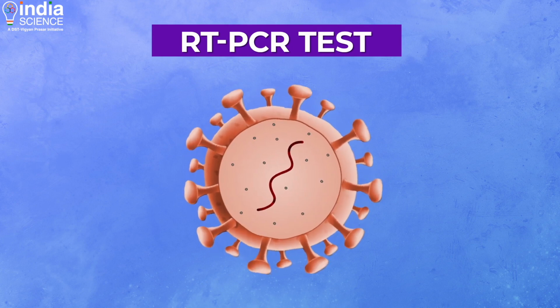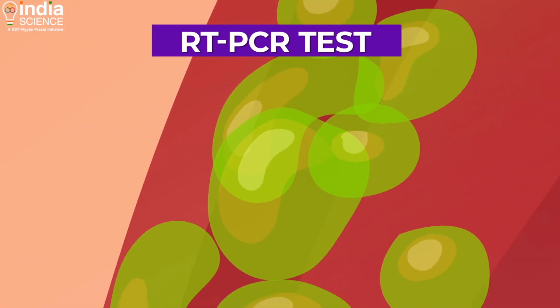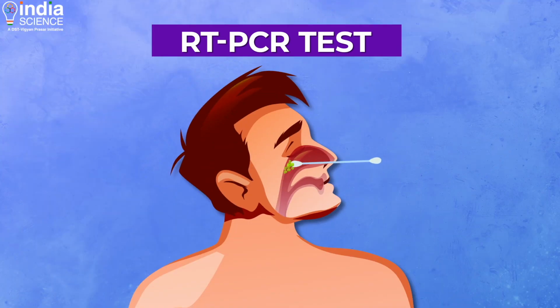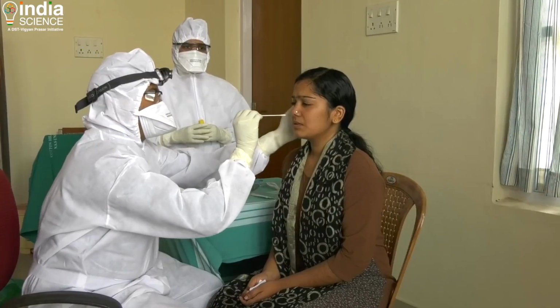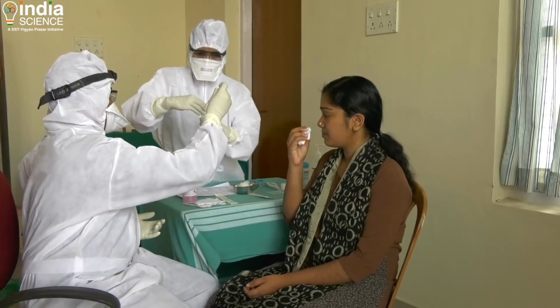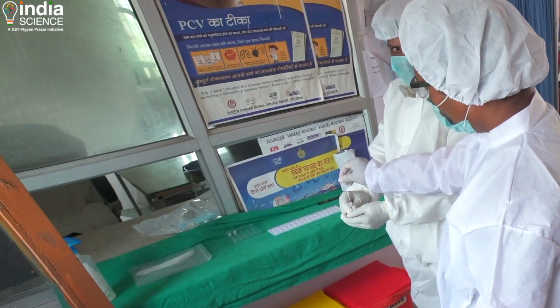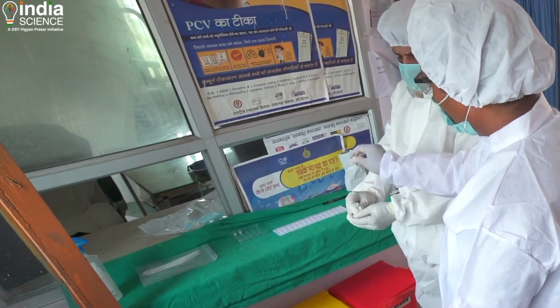So the virus we are talking about, SARS-CoV-2, is an RNA virus. So the test detects RNA in your nasopharyngeal sample. The sample is collected from your nose. Put your head up and you get a sample. Throat or nose. So that will collect some of the viruses in your respiratory tract.